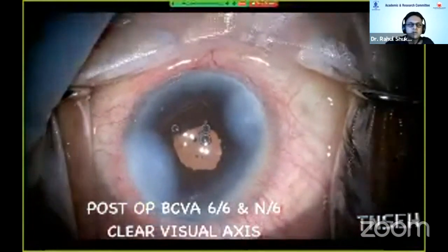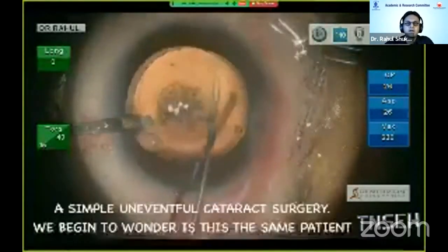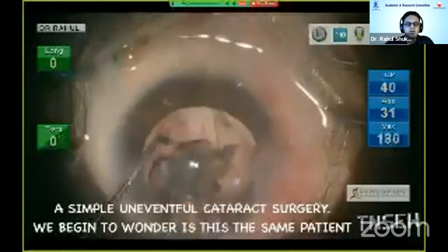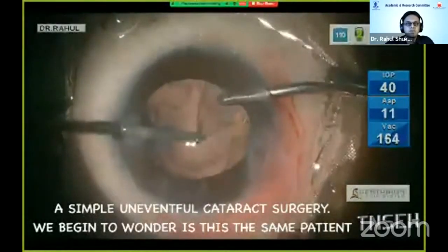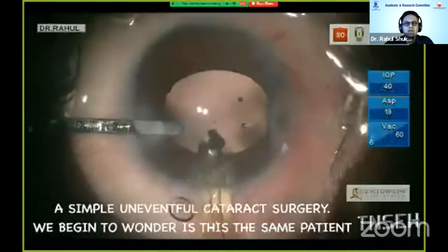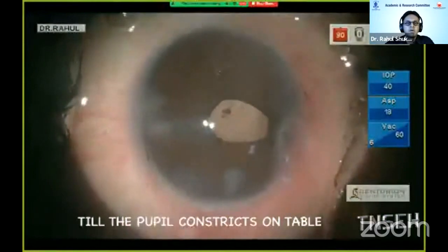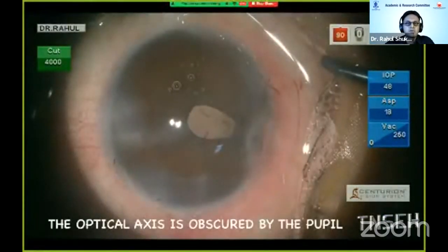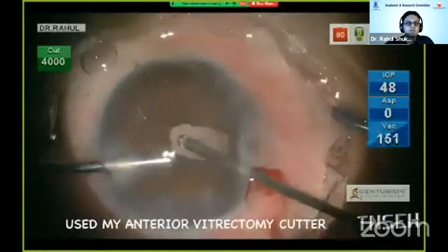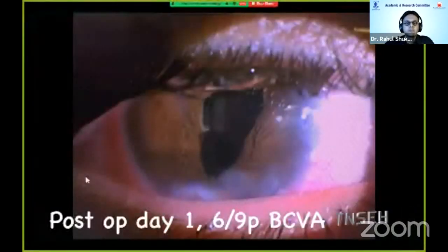I get some amount of confidence, so I can go to another case wherein we have an adherent leukoma with subcapsular cataract, 6/24 vision. Surprisingly, the pupil dilates very well. It's an uneventful cataract surgery, and we begin to wonder, is this the same patient? Doing all steps meticulously, making sure you put an IOL in the bag, I try to break the anterior adherent leukoma, which I am unable to. Again, my vitrectomy cutter comes into play. This time I'm more adventurous, so I create a huge opening. I don't have the idea what to do, but then the patient is 6/9.